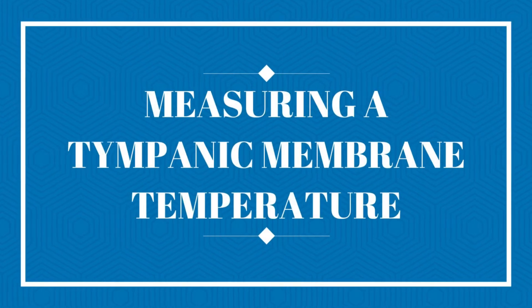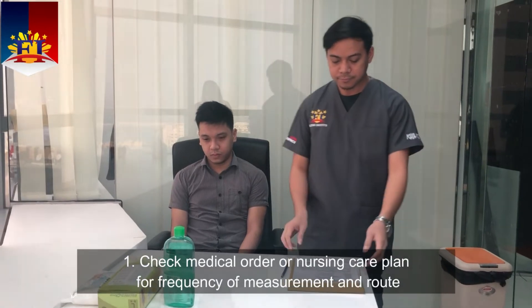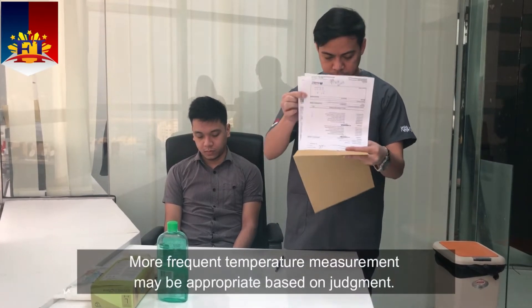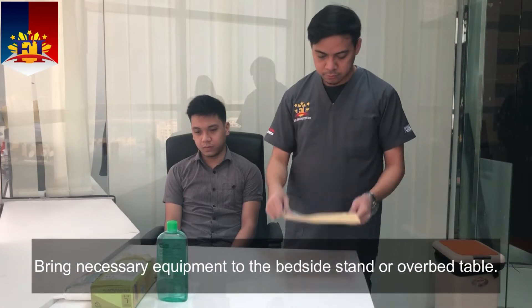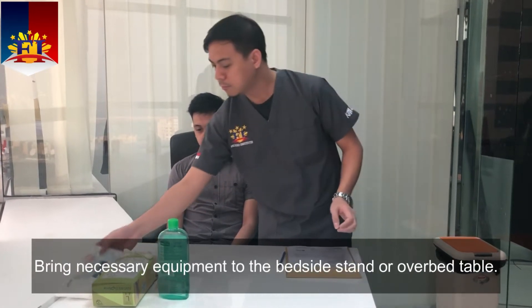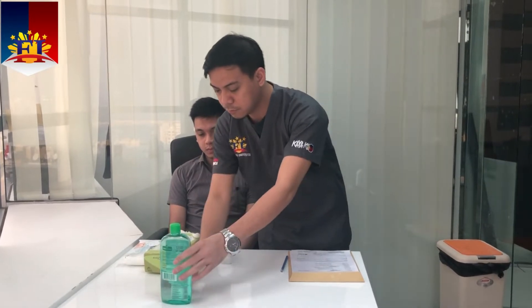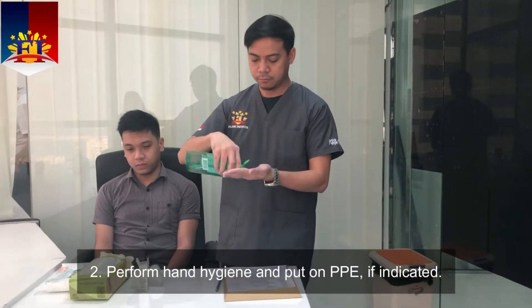Measuring a tympanic membrane temperature. Check the medical order or nursing care plan for frequency of measurement and rationale. More frequent temperature measurement may be appropriate based on clinical judgment. Bring necessary equipment to the bedside stand or over-bed table. Perform hand hygiene and put on PPE if indicated.